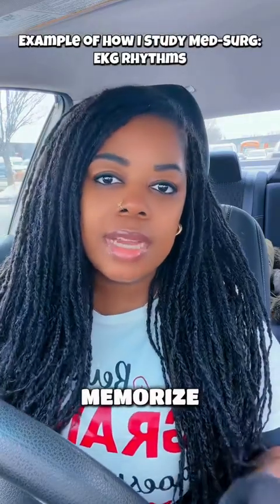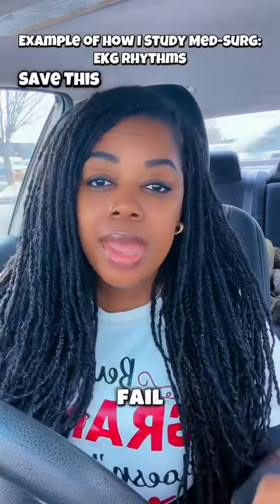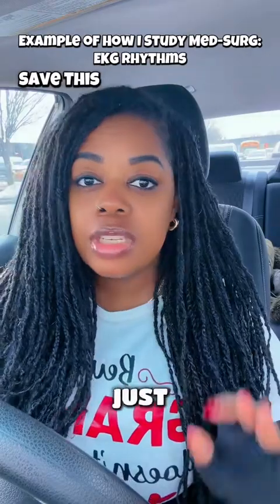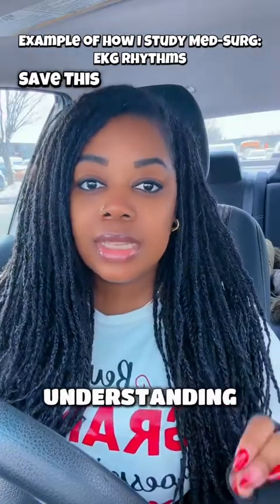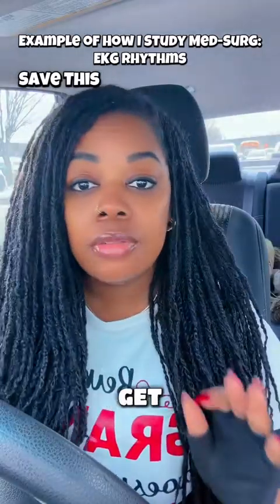Y'all, stop trying to memorize EKG strips. You're going to fail your Med-Surg exam if you're just looking at the pictures. Okay, so let me show you the secret to actually understanding them so you never get a rhythm question wrong again.